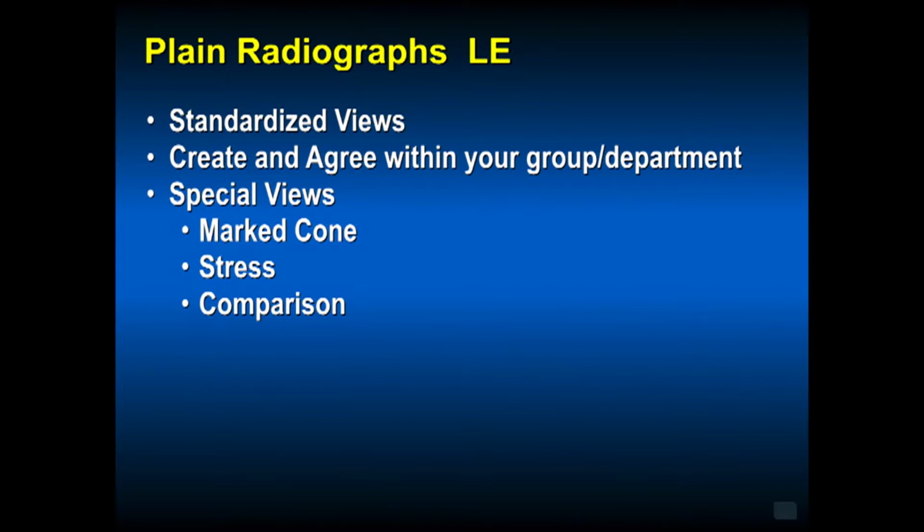For example, I try to get the same degree of flexion PA views for knee patients who come back for osteoarthritis, so we can compare year to year. These need to be weight-bearing views to determine the extent of the osteoarthritis. Non-weight-bearing views don't really help us a great deal in osteoarthritis of the knee.